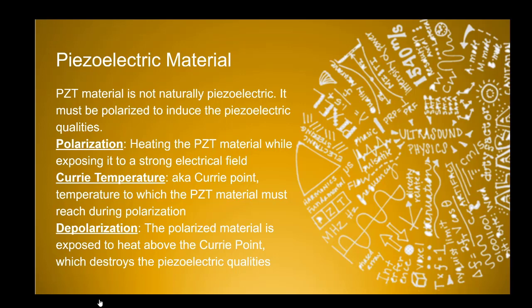PZT material typically is not naturally piezoelectric. It doesn't mean that if you found a rock, a quartz rock out in your rock garden or out in your yard, that you could hook up an electrode to it and create sound waves out of it. That's not what that means.